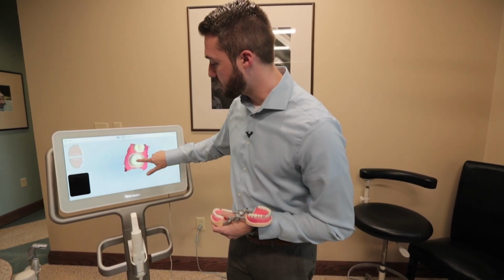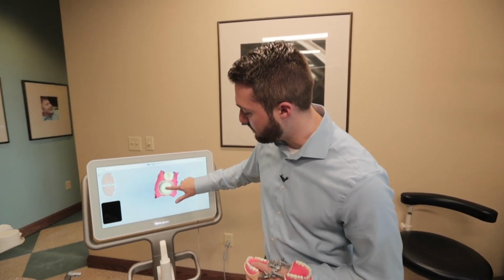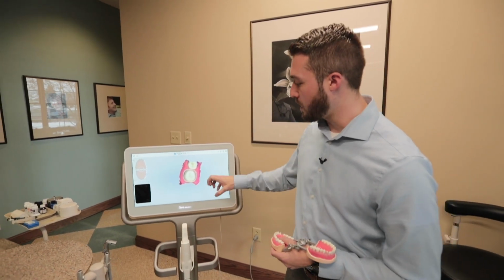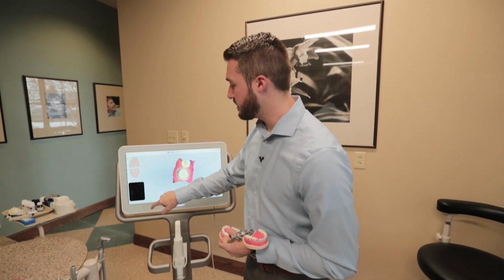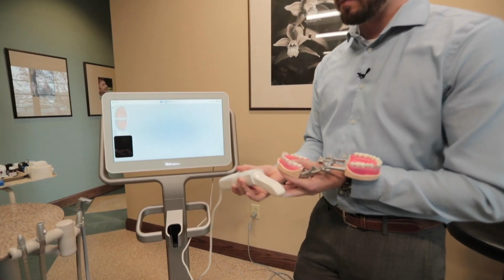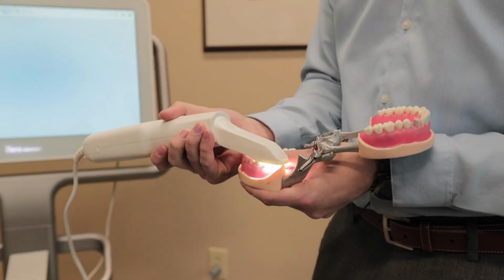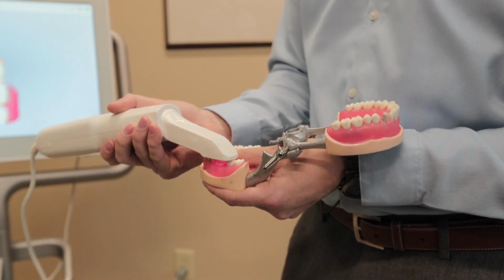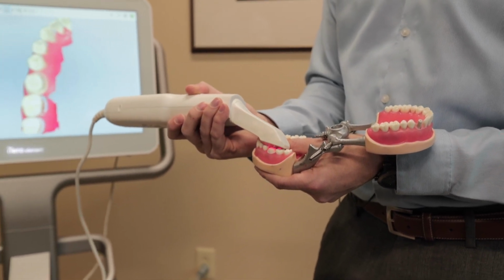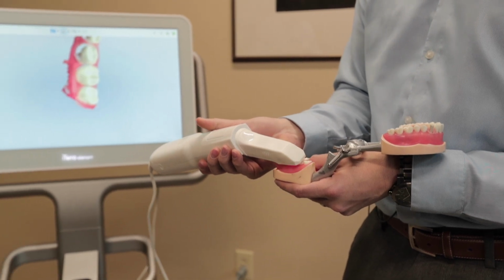So we go there, we take this green dot, we just want to make sure it's in the center, so we move it there. That just has to do with the path of insertion and also notating that this is the prep arch or the prep section. All right, we're then going to hit the arrow. We're going to go over. Now we're going to do the arch. I'm just going to go ahead, scan right on the tooth surface, occlusal lingual buccal. So turn it on. We're just going to build our scan up and go about a 45-degree angle. Build up your image. Rotate over to the buccal here. We're just going to go through.